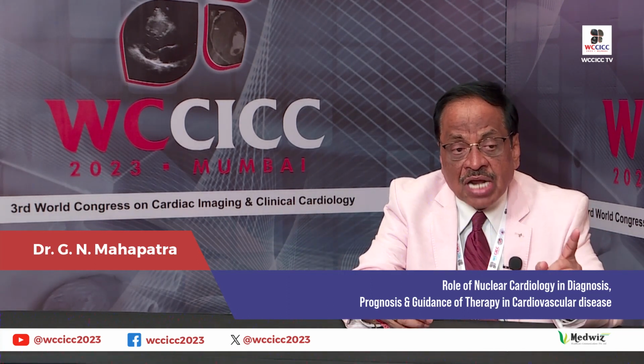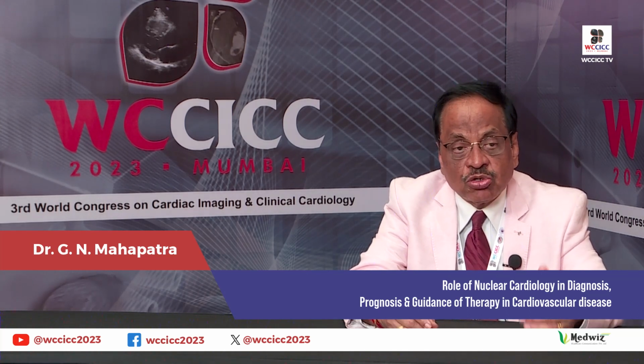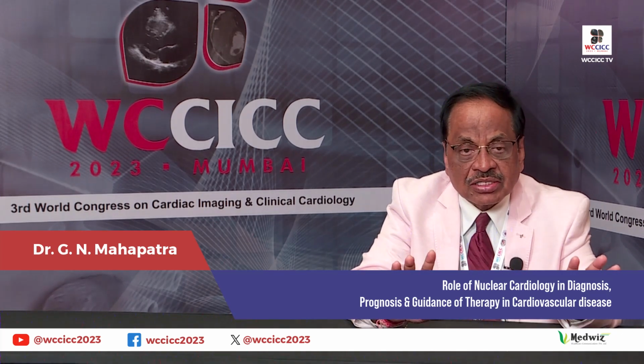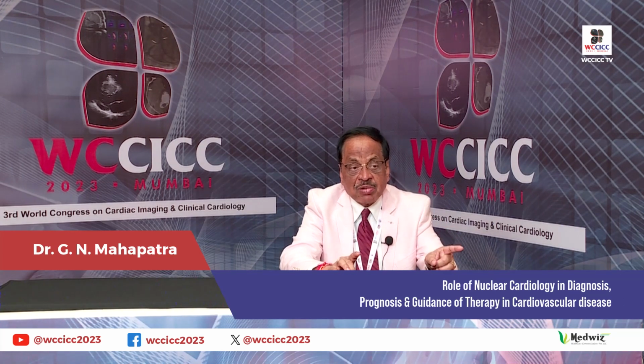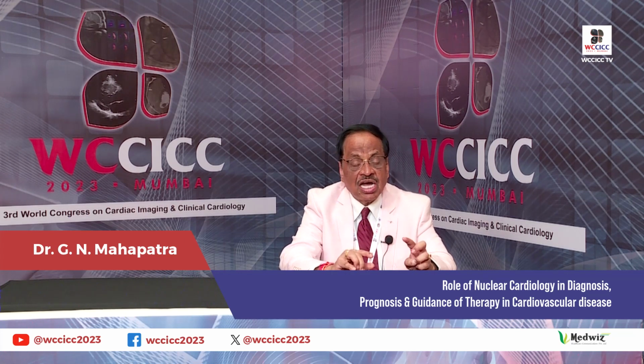So we have to diagnose it, and our nuclear medicine methods like F18 sodium fluoride and gallium-68 DOTATATE are the agents which you inject. They do not have any side effects. They can go and detect, look, this is an atheromatous plaque which can break or dislodge at any time.